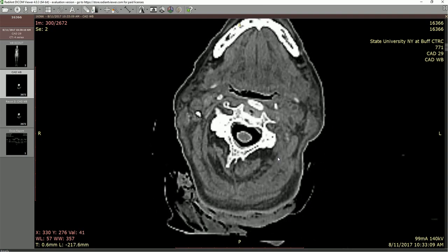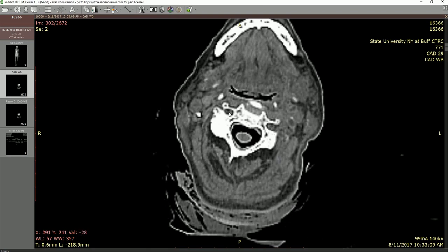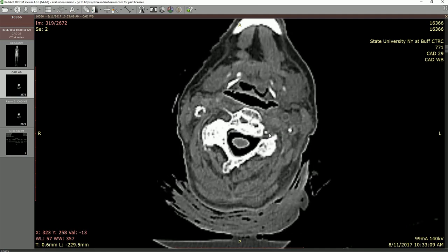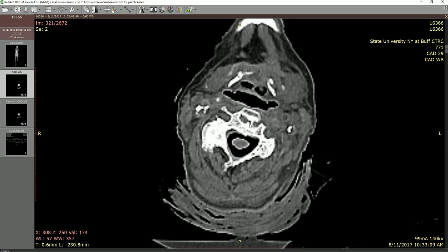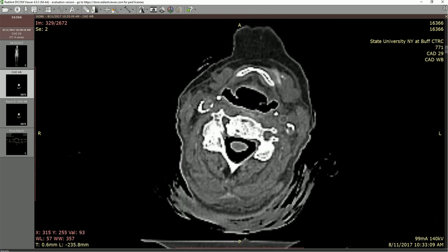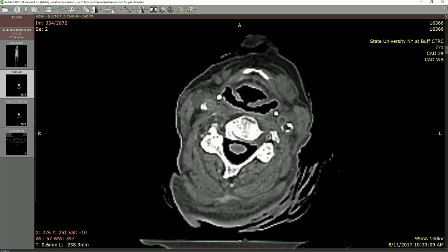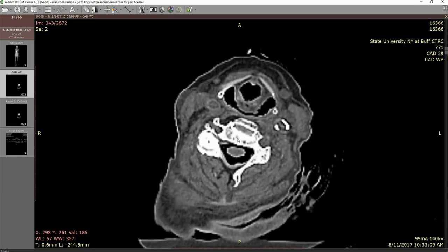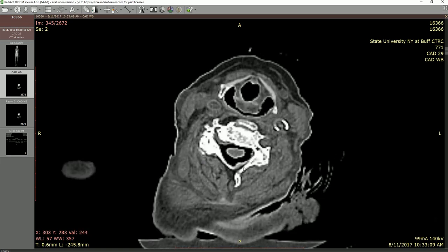Moving further down into the cervical region, you can see the foramen transversarium — you'd have the vertebral artery within that space. Going further down still, this should get us into the intervertebral foramen where we would have the spinal nerves exiting. The body of the cervical vertebrae shows some pathology and deterioration — this is an older individual. As we go through the cervical region, we're going to see a lot of calcification of cartilaginous structures and a lot of pathology to the bone tissue. Identifying the individual muscles is a bit beyond what you need for this course.